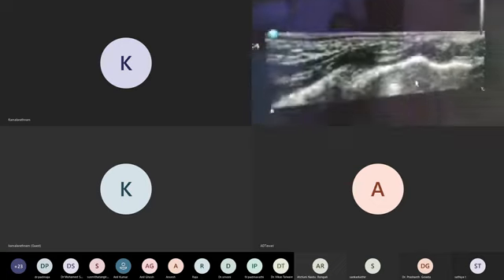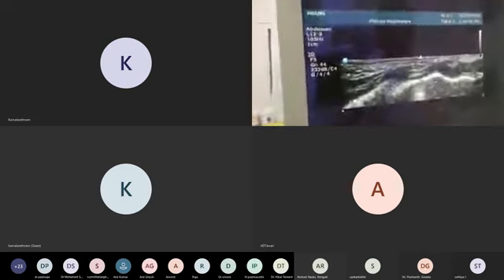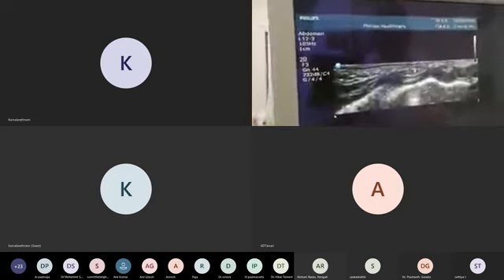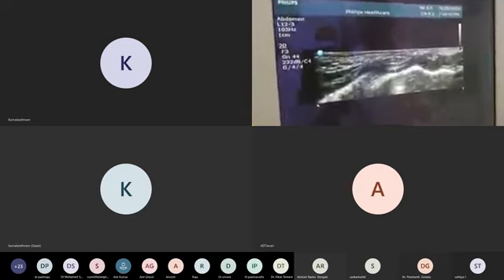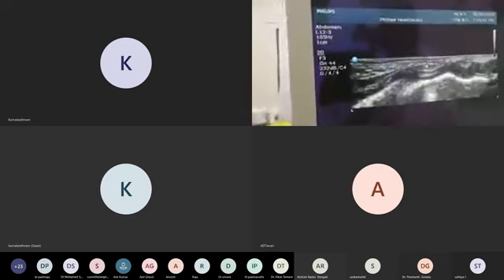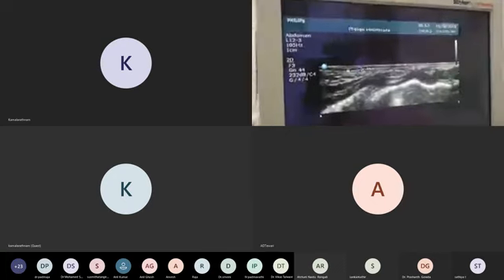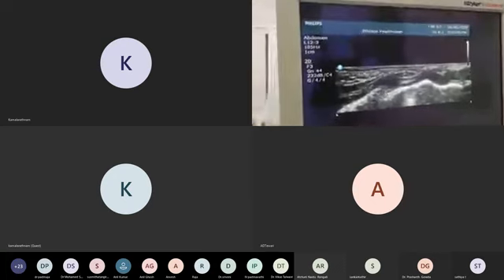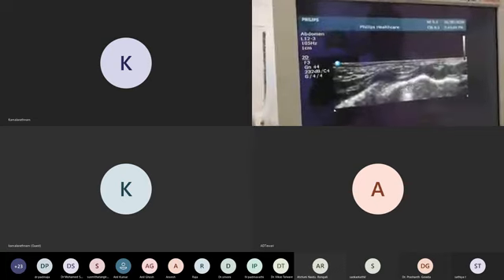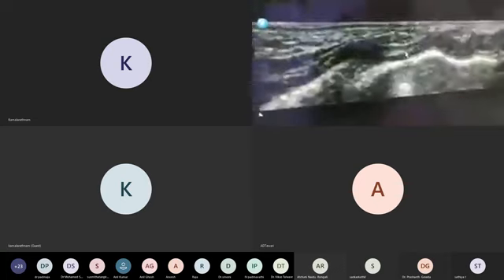Okay, and now, this is the skin, subcutaneous tissue. This is the muscle. This is the muscle. Skin, subcutaneous tissue. This is the muscle. This is always fixed wherever you go in the body. Only this fellow is moving. Yes or no? If it is fixed, how does it look in the M mode?